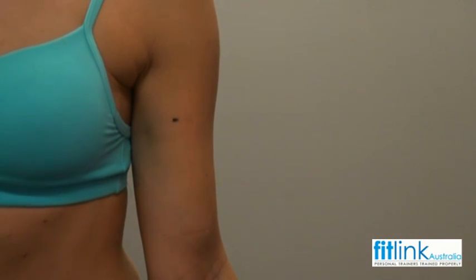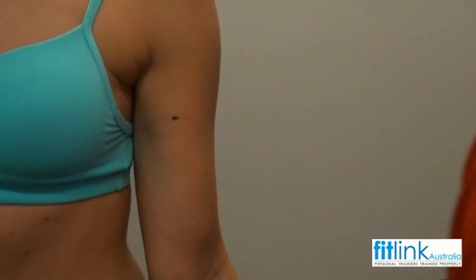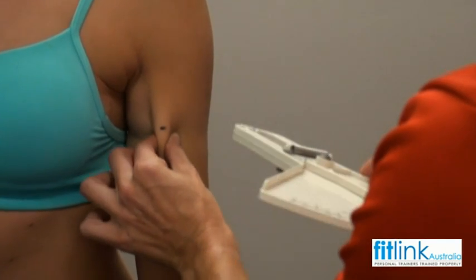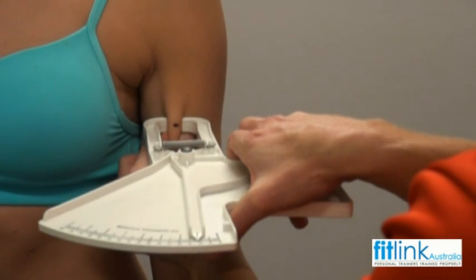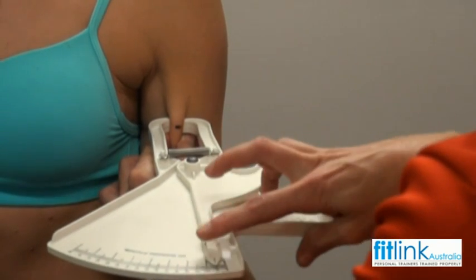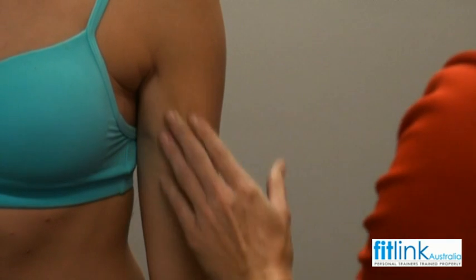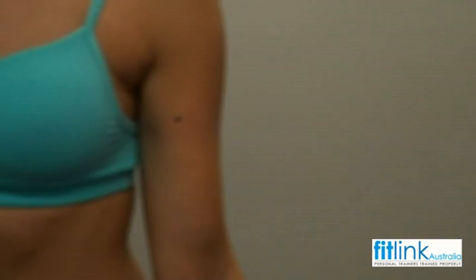So I'm just going to take all the skinfold readings now. Standing in the anatomical position, always looking forward. I'm just going to grab hold of the skin, making sure my mark's in the middle of my skinfold, place the calipers on, and look for my measurement. That's five millimetres. I'm just going to let that skin relax for a couple seconds, and I'm going to take a further two more readings from that spot.